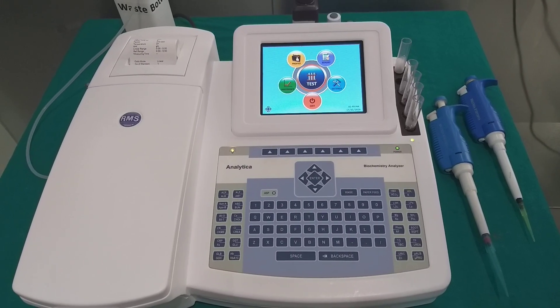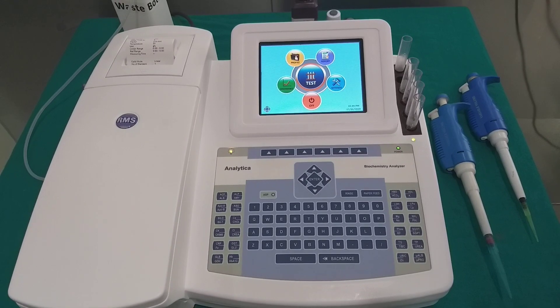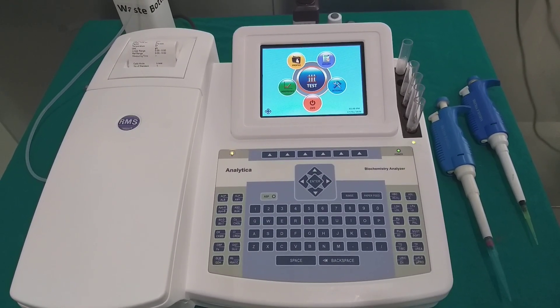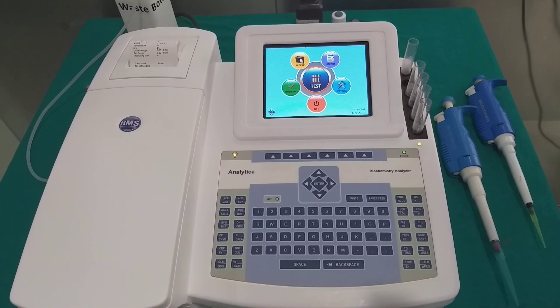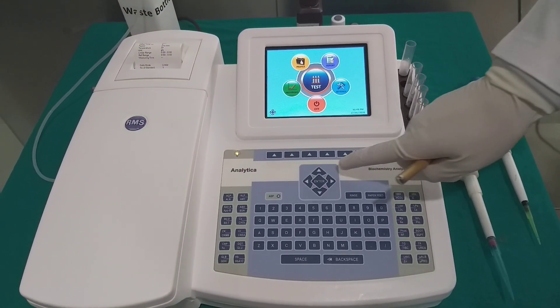Analytica Biochemistry Analyzer is capable to perform tests on serum, plasma, CSF (cerebrospinal fluid), and urine samples. The analyzer has the capability to store 10 test profiles such as liver, cardiac profile, renal, and lipid profile.